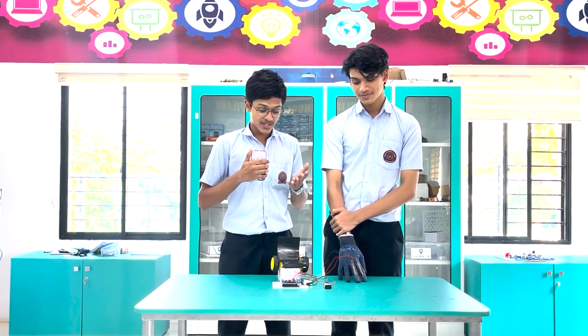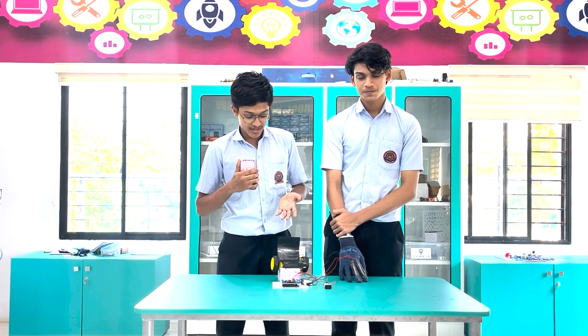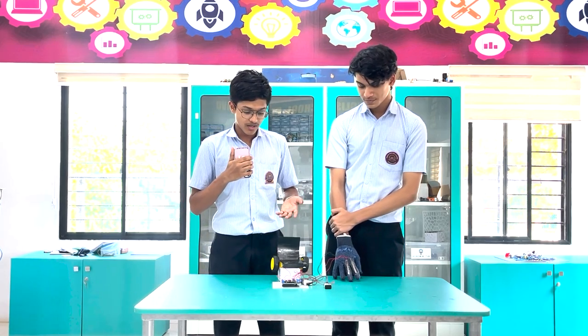Hello, my name is Abdul Basit and this is my partner Hisham. This is our project for the ATL Marathon — a flex sensor rover that helps people with disabilities access a wheelchair more efficiently.